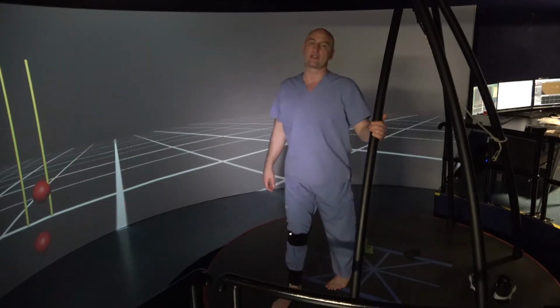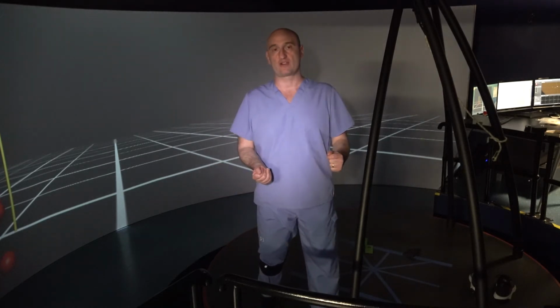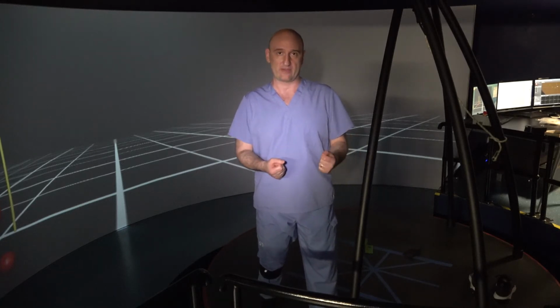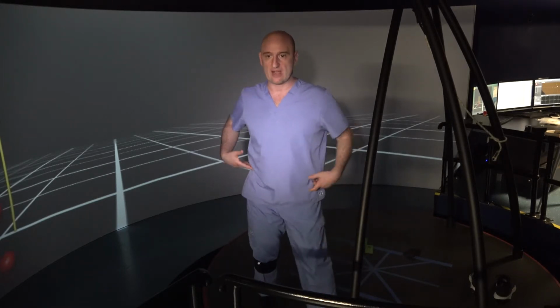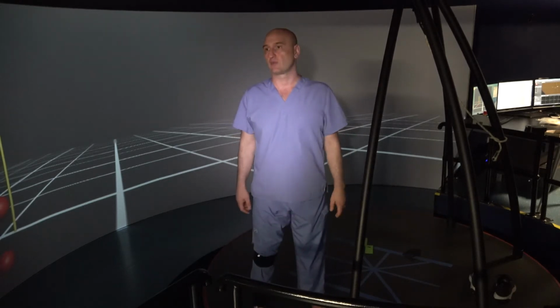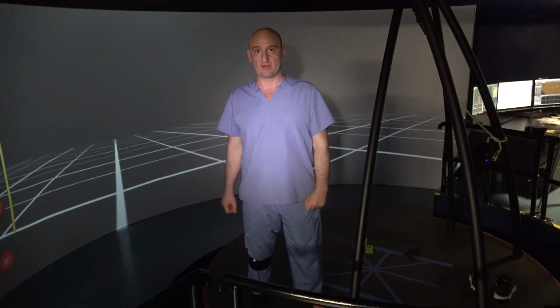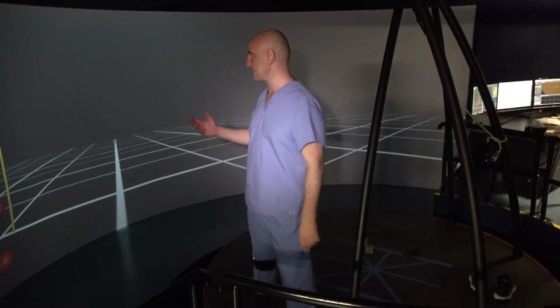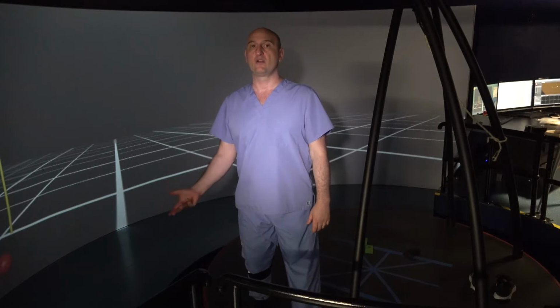So how do we use it? We can perform motion analysis here on the person, or for example, if it's a patient who's a runner or has difficulty walking, we do gait analysis. We have a 3D gait analysis. There's a very comprehensive report, and we can see what's wrong with the person, whether the pelvis drops, whether the knee goes valgus, whether the ankle pronates too much, whether the trunk leans, all those kinematic parameters. So once we see it there, whether it's walking or sports or motion analysis here, we immediately know what's going on.